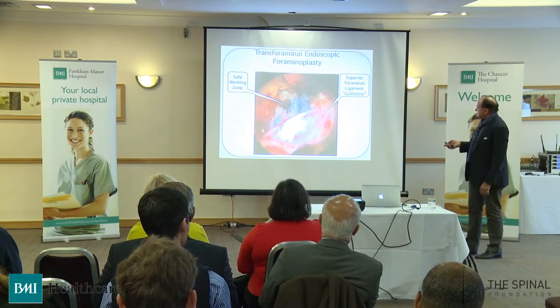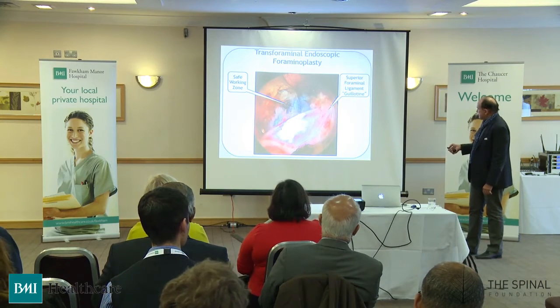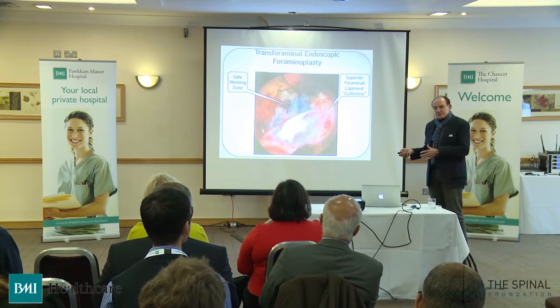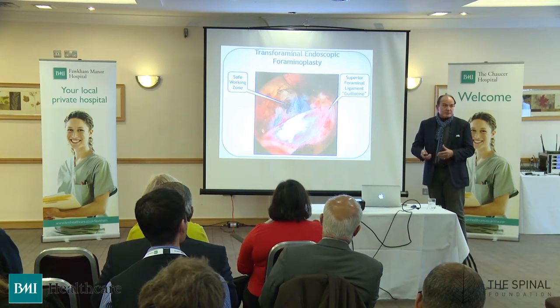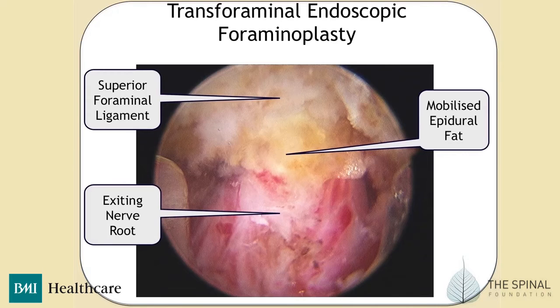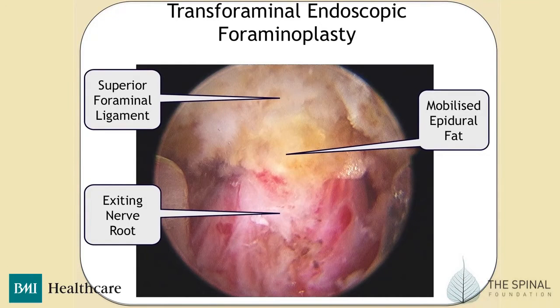Having worked some time in France, we tend to christen this ligament as Madame la Guillotine, because as you lose disc height, of course, that ligament starts to impinge further onto the nerve and cause irritation, and is often found bound to the nerve. So when you've done an effective clearance, maybe getting some color bleeding here today, here's the epidural fat coming through, here's the nerve. Now the nerve should be a pale color similar to the walls of this room. Here, after the constant irritation, you will see that it's very inflamed and red.